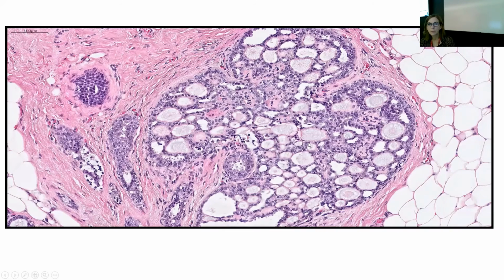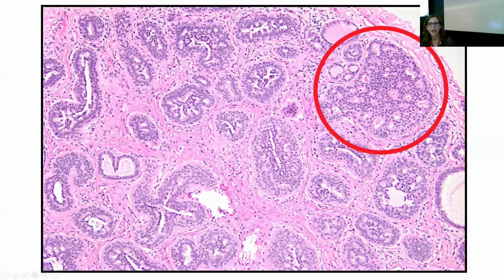Collagenous spherulosis can be a pitfall. That can be a mimic for ADH and low-grade DCIS, but look for the myoepithelial cell nuclei that are not polarized, but rather running parallel to the spaces and the basement membrane material. And then, Eddie might talk a little bit more about that later on as well.